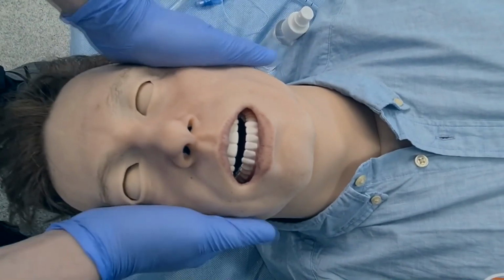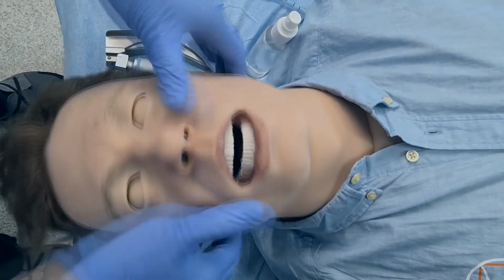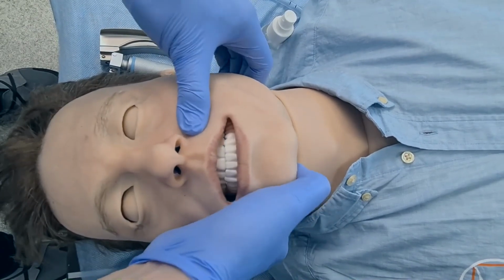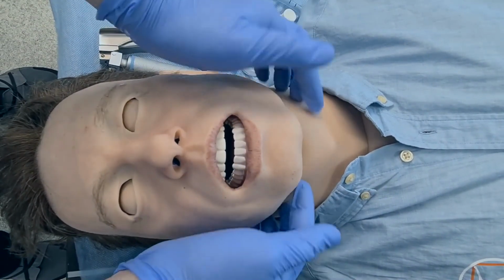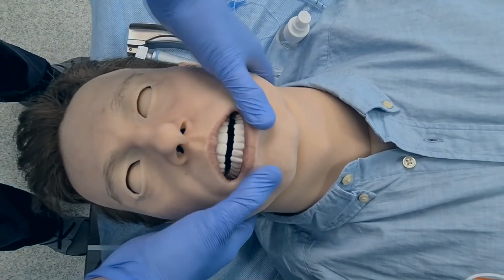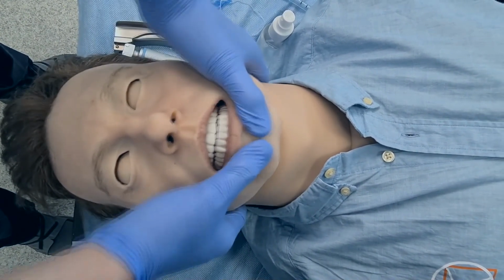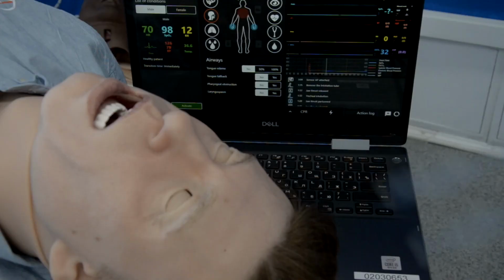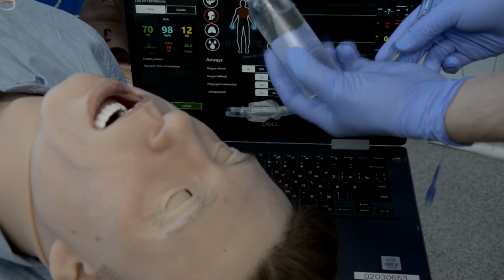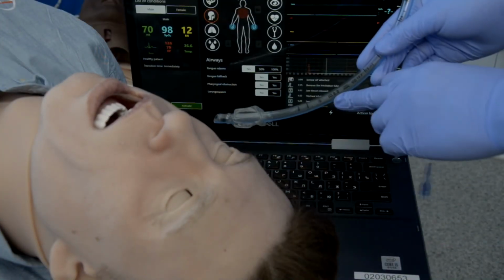And let's have a closer look at Leonardo's soft jaw. Get a lot of compliments on it. So here's the jaw thrust with a sensor, and it's nice and soft and has a complete range of mobility, and even has realistic underjaw anatomy so that you can do various maneuvers. Leonardo's lockjaw. There it is, and it's pretty strong. Before intubation, we always recommend to use the included lubricant, and you can also prepare this yourself, as this is a mix of glycerine and water. And Leonardo patient sim will take tubes from 7 to 8.